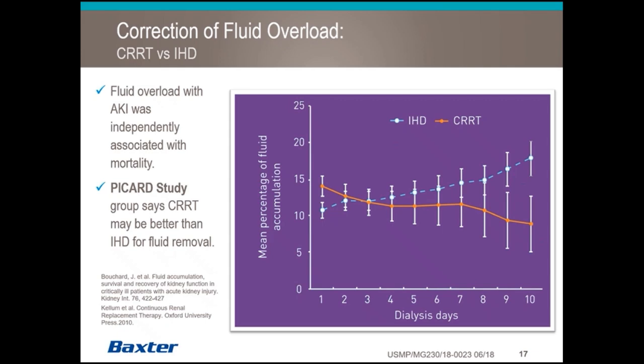Also, larger volumes are removed with IHD and SLED. This increased risk of excessive fluid removal can lead to hypovolemia and hypotension and can slow renal recovery. With CRRT, you have regular recording and adjustment of fluid losses and gains, and this allows for precise management of patient fluid balance. CRRT also allows for the progress to be made at the appropriate speed and direction to achieve the prescribed goal for the patient.